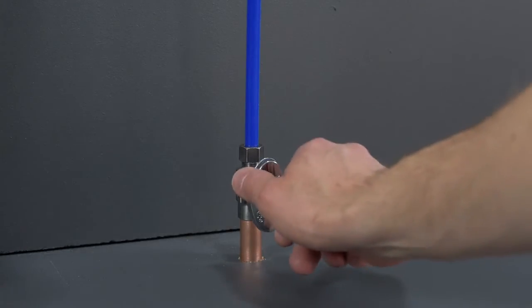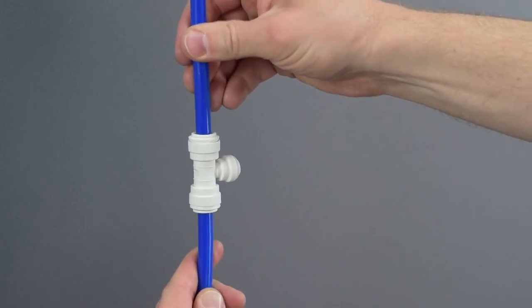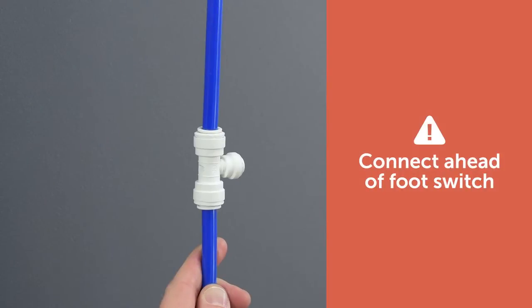First, turn off the water supply. Tap the cold water line with a T, valve, or compression valve so the ¼ inch polyurethane tubing can be connected. Be sure to connect to the cold water supply ahead of any foot switch that might be present for uninterrupted water supply.